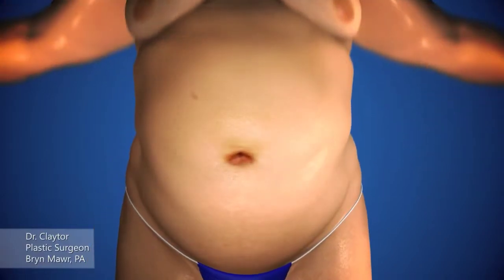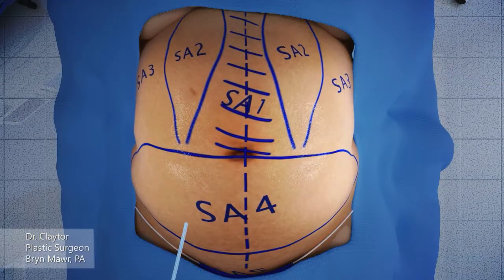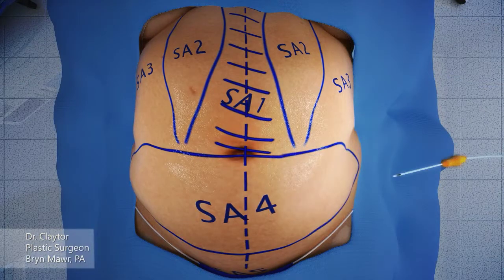I'm Dr. Claytor. I'd like to demonstrate the abdominoplasty technique with concomitant liposuction, no drains needed.